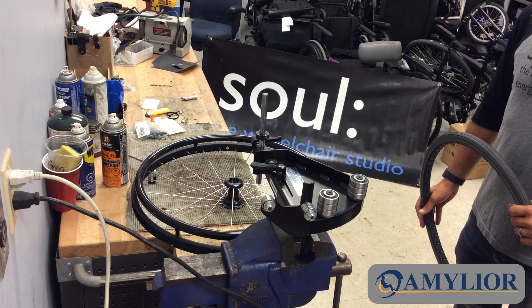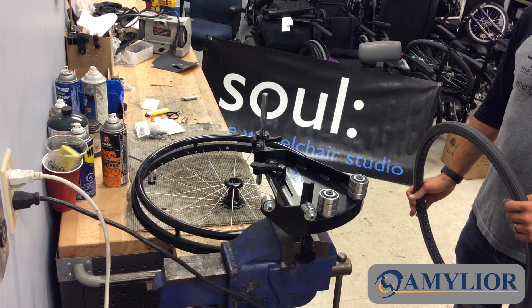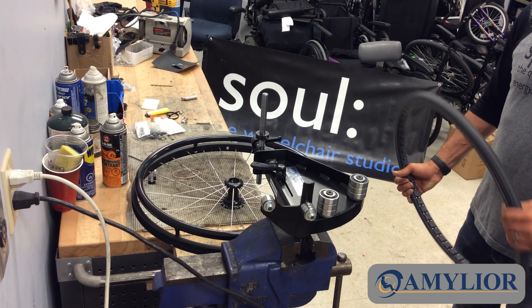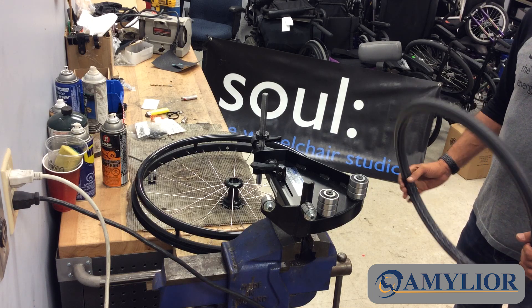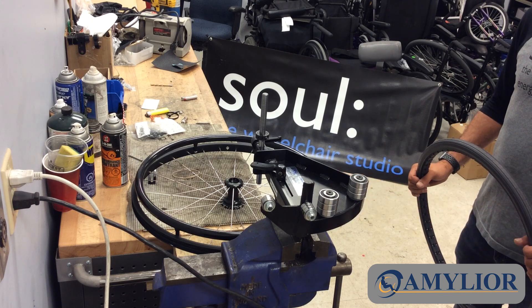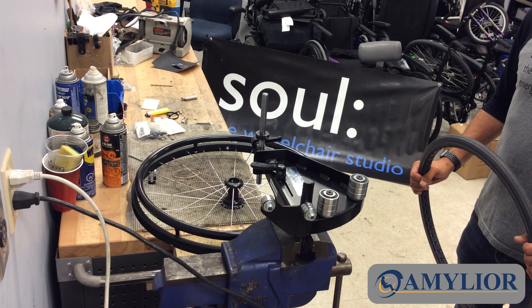Good morning everyone. Here we are at Sol, the wheelchair studio. We're going to install a tire, a urethane tire, onto a rim. We're using a 22 inch rim, and the device we're using is the CG Tire Installer from Amelior.